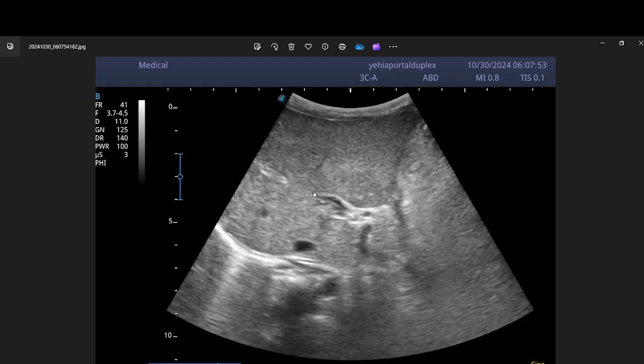What was this? This was portal vein cavernomatous transformation, or cavernous transformation, also known as portal vein cavernoma. What is a portal vein cavernoma? It is a process that happens because of chronic portal vein thrombosis. Then we have a thin, echogenic, cord-like portal vein that is not functioning, so it is replaced by multiple collaterals that take the course of the portal vein, trying to supply the liver.